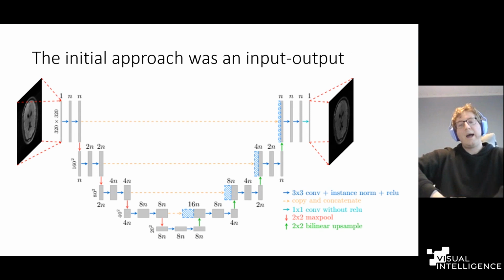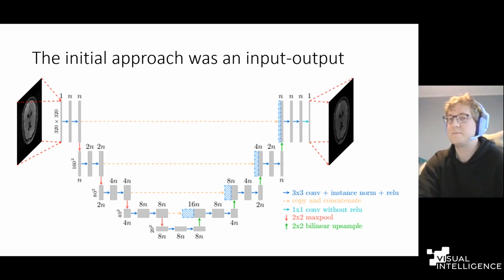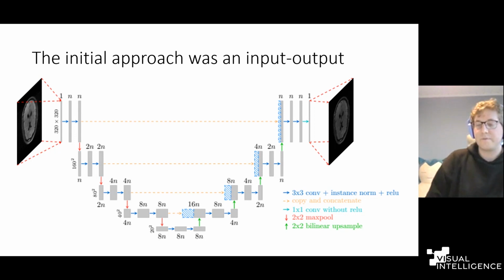So how do you go from the downsampled image to an image of clinical quality with deep learning? Well, the initial approach, and one of the first ones, this was far earlier than when I started with this, was to quite simply give a model, a UNet for example, UNet works great in medical imaging.